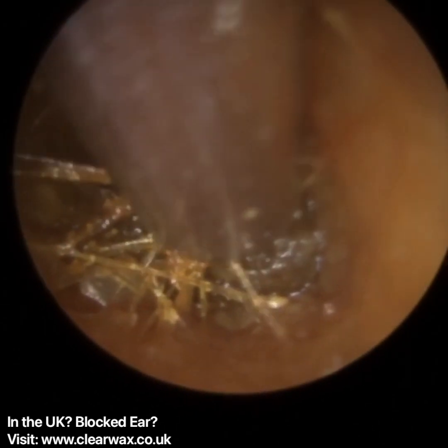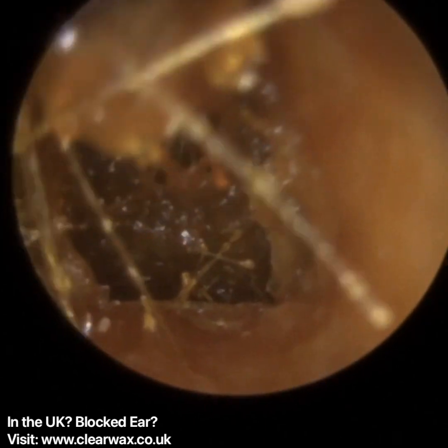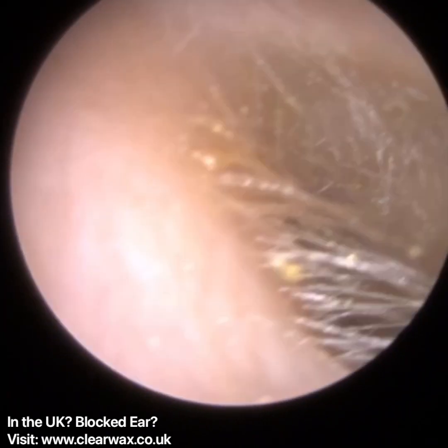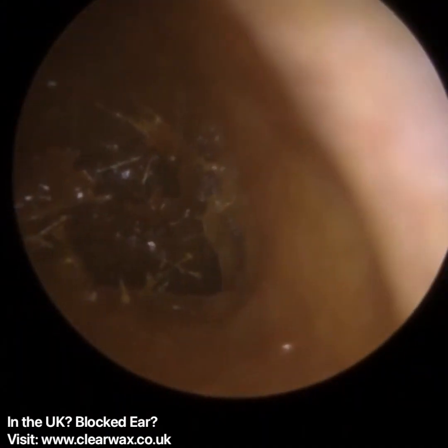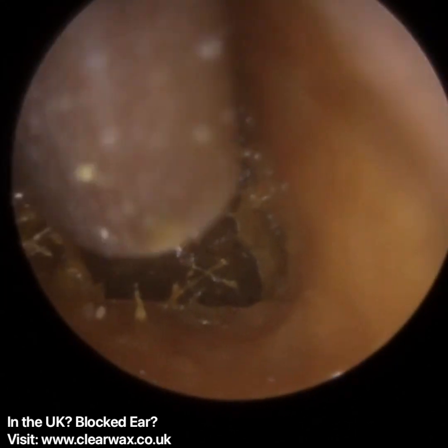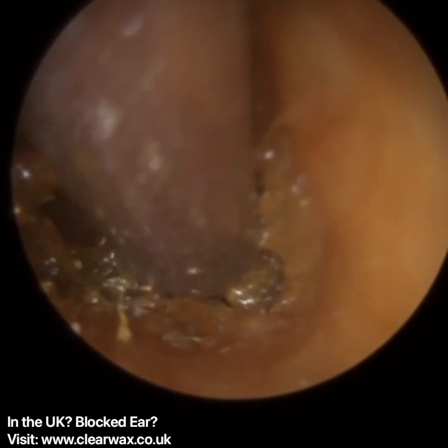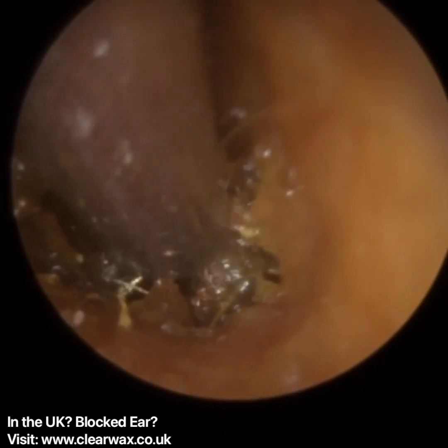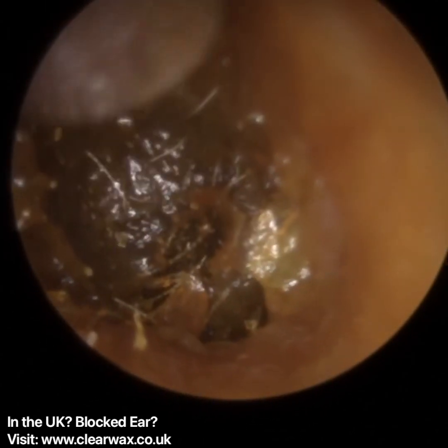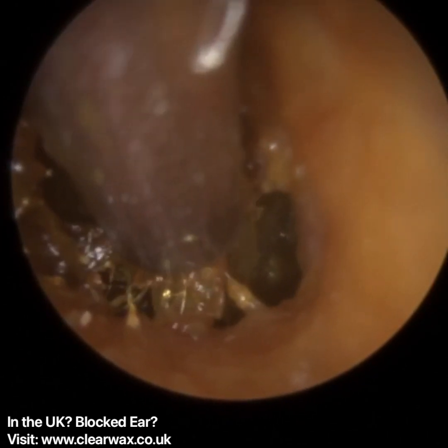If you're a medical professional or student, you've got the stool chart. I forgot the full name, actually. The different types of stool, the different consistencies, give you an indication of your current health. And if there was an earwax chart, this would most definitely be in the diarrhea category, and it's a horrible consistency. Hydrogen peroxide drops generally have this effect. Now, it could just be this is the patient's natural consistency, but I think the drops definitely played a part.